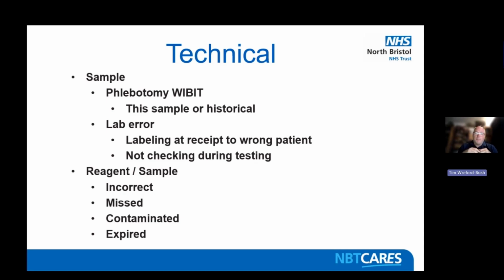You ask to do a group, you pick up a sample, you presume that's the sample, you haven't done a proper check of it, you just do the tests, and you get the wrong result. So that's the lab errors for sort of booking in and processing.